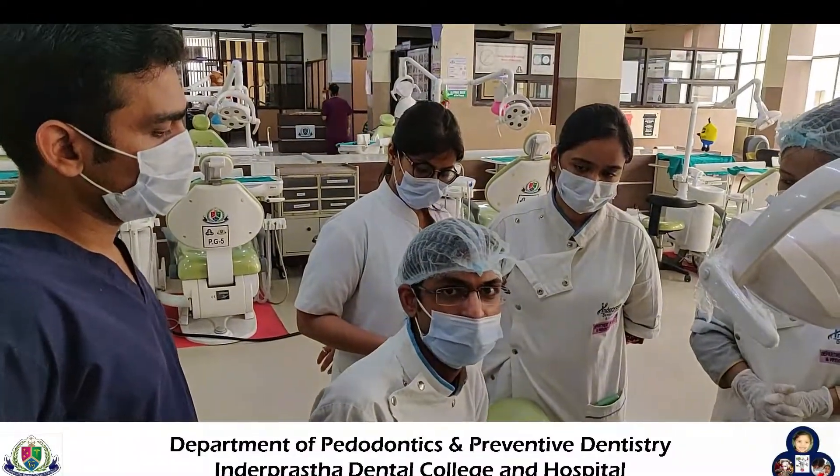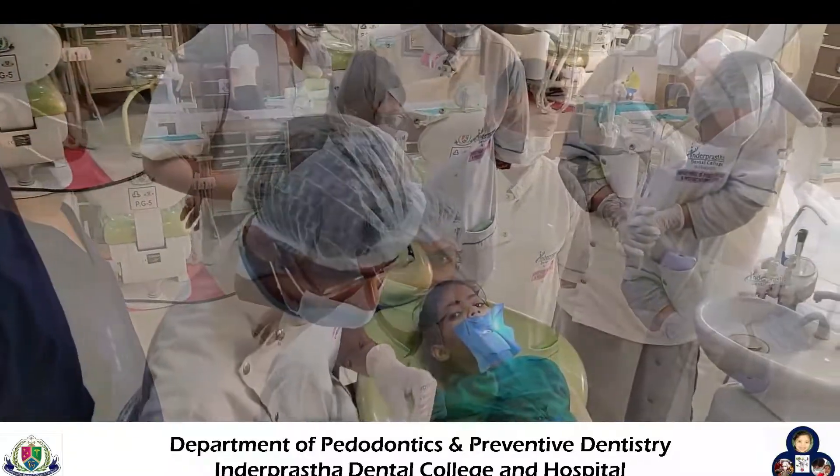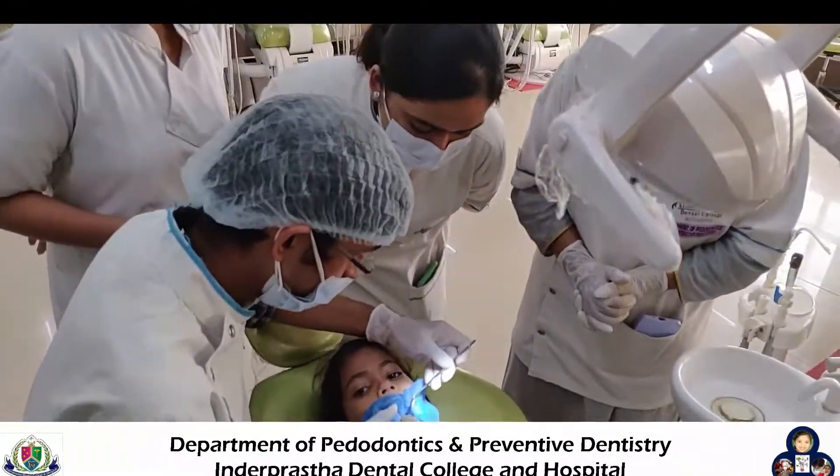Composite restoration. For composite restoration, proper isolation is required. In our patient, we have used rubber dam isolation.